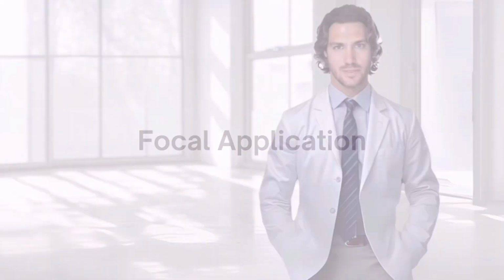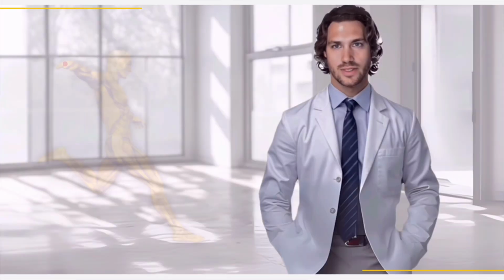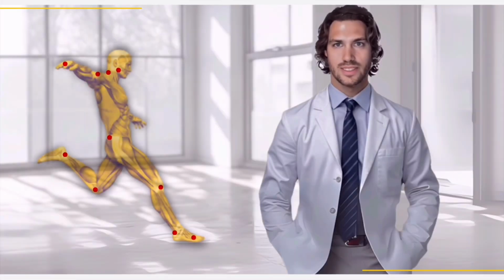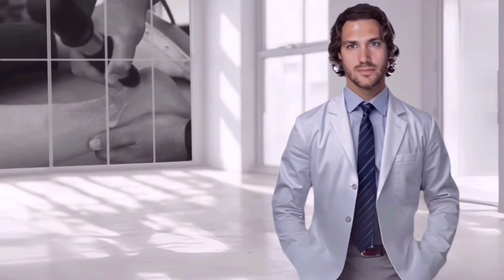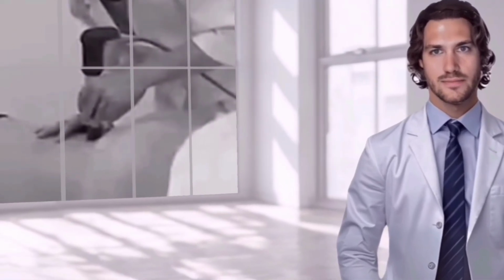Let's start with the difference between focal and global shockwave application techniques. Focal applications are static, focused on concentrated energy delivery to a single target tissue. Providers often cradle the outer edge of the transmitter tip between the thumb and index fingers for targeted treatment. Examples of focal shockwave application: insertion of the Achilles tendon, trigger point therapy.